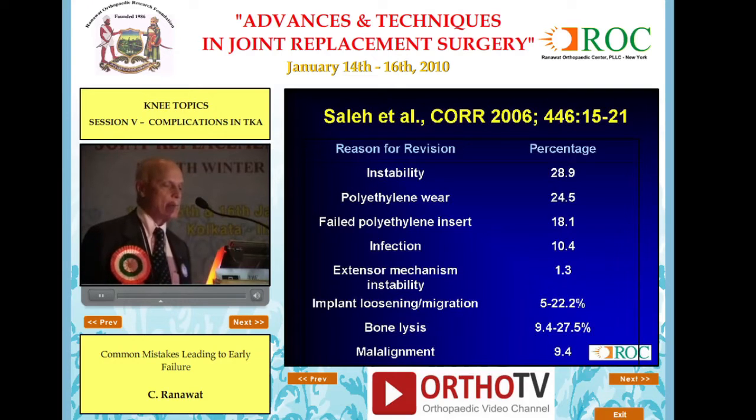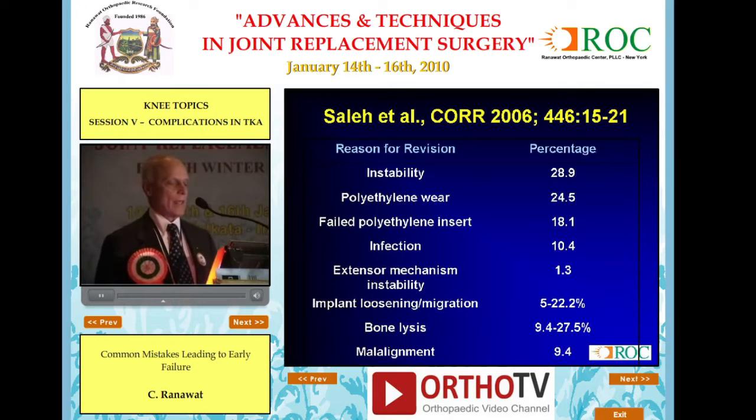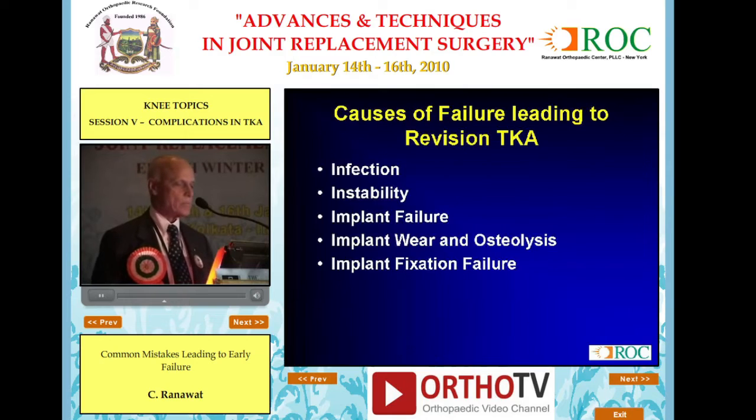I did a meta-analysis and published here and listed the causes of failure of all published reports, and they are like this: instability, polywear, and infection. Here's the list. To simplify, from my personal experience, these are the reasons I do revision: infection, instability, implant failure due to wear or breakage, wear and osteolysis, and loss of fixation.